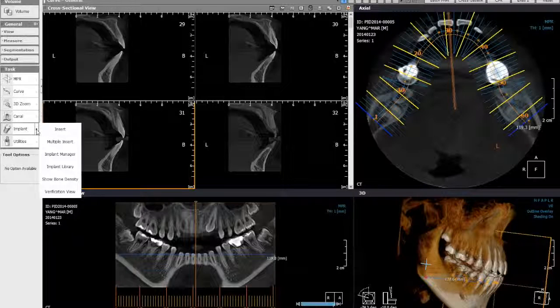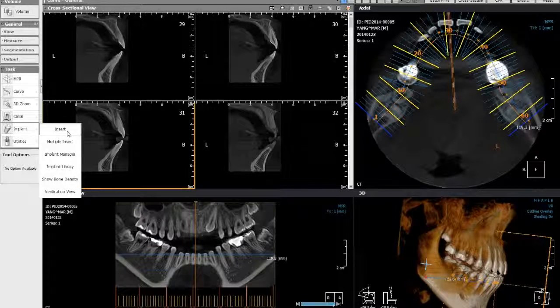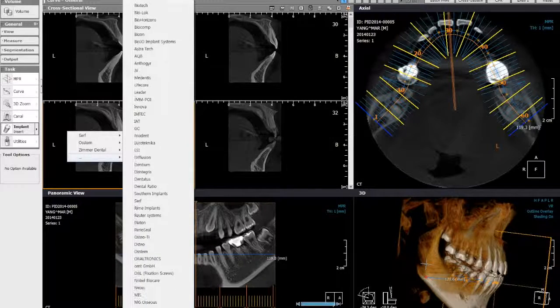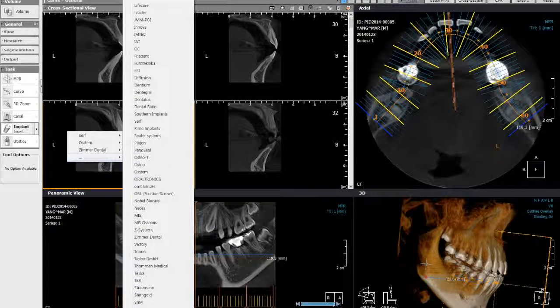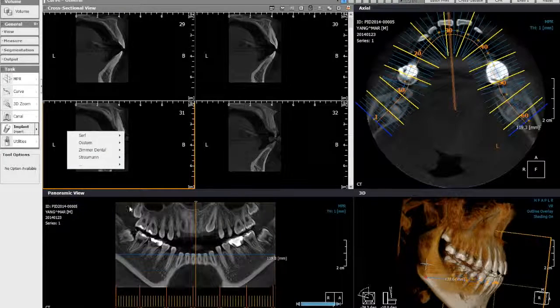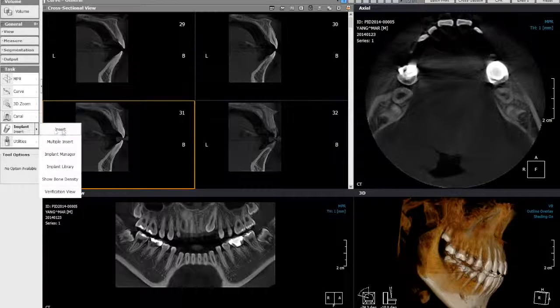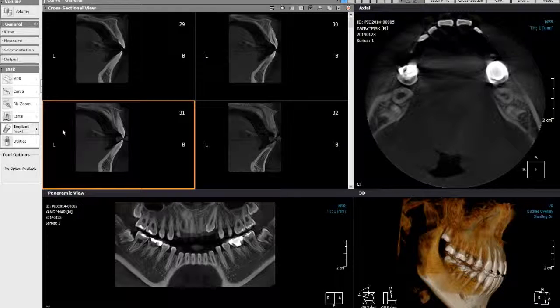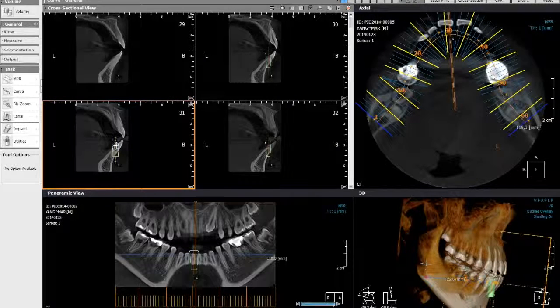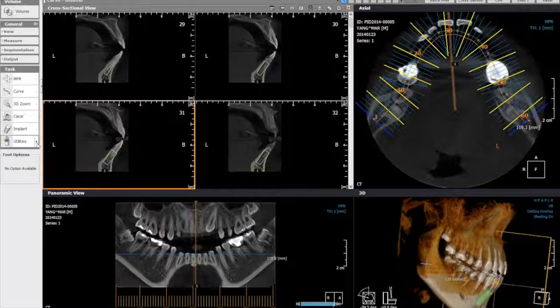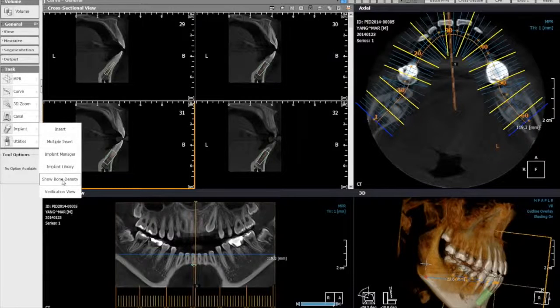If you would like to place an implant, you have multiple options. You can manage the implant library, but most of the time you can simply insert an implant. Choose the manufacturer you are looking for — from the library you can pick your preference, and most common manufacturers are available. Once ready to insert, choose insert and drop the implant where you want, then move the implant and change the angle. You can see it in any of the views as well as in the 3D representation.